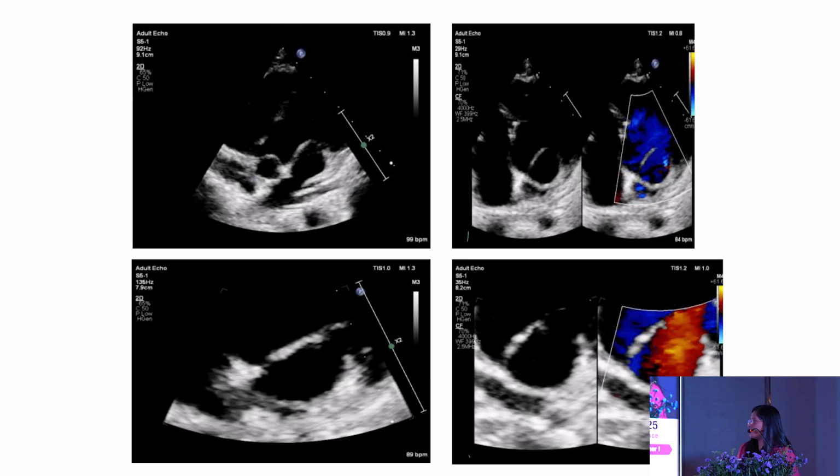At the classical 4-chamber view, while giving an anterior tilt, we can exactly make out the attachment of the thin linear structure. Even at the zoomed level of the mitral valve, the thin linear structure, which is hyperechoic, is attached to the superior aspect of the interatrial septum, crossing the coapting zone of the mitral valve and attached to the lateral papillary muscle, causing trivial to mild mitral regurgitation, and there is no significant gradient across the mitral valve.